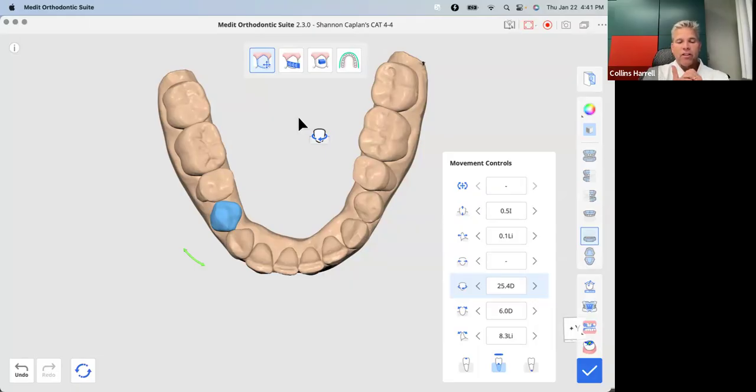And so you think about your aligner cases in this same way, especially because you're going to be paying for these aligners per aligner. And we do have a price cap for progressive grads. So if you're a POS graduate, you will have each case price capped at $1,200. So you won't go more than that, which is actually a really great deal. But you really don't want to order a bunch of aligners and throw them away.